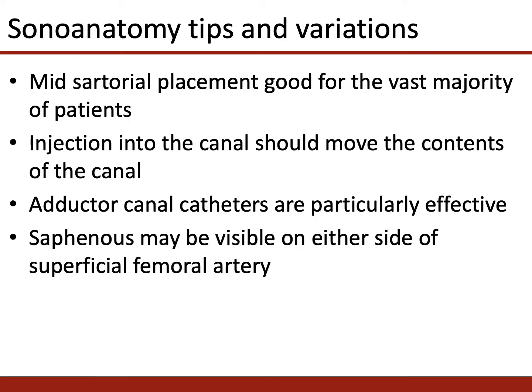For sonoanatomy tips and variations: mid-sartorius placement — where the vessels are mid-sartorius — is a good choice for the vast majority of patients, giving a good chance of blocking both the saphenous nerve and the nerve to vastus medialis. Injection into the canal is into a fixed space, so it should move the contents of the canal; a successful block will show the femoral vessels moving as local anaesthetic is injected. Adductor canal catheters are particularly effective and have transformed outcomes for patients undergoing knee surgery. The saphenous nerve may be visible on either side of the superficial femoral artery, as it changes position relative to the artery as it traverses the canal.